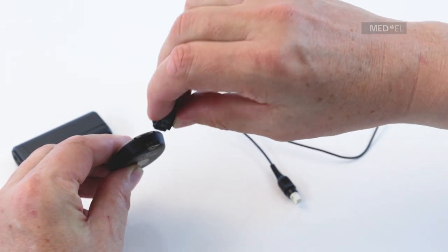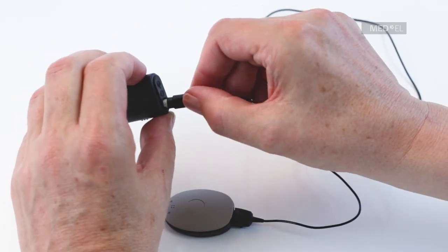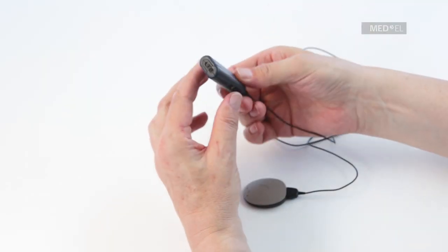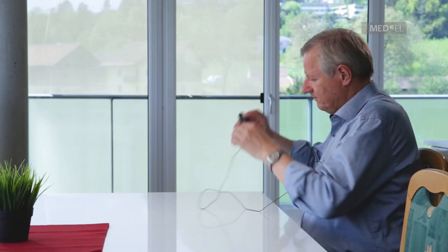Plug the Mini Battery Pack cable into Rondo 2. Plug the other end of the cable into the Mini Battery Pack and switch it on. The Mini Battery Pack can then be attached to clothing or worn in the pouch provided.